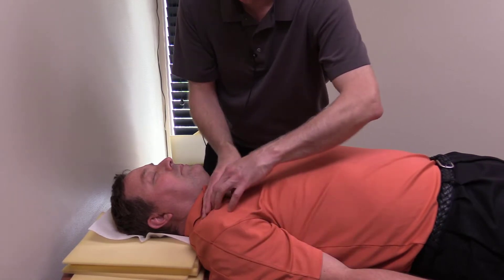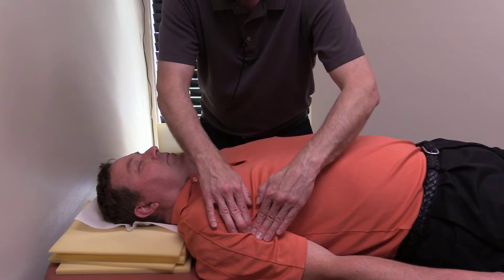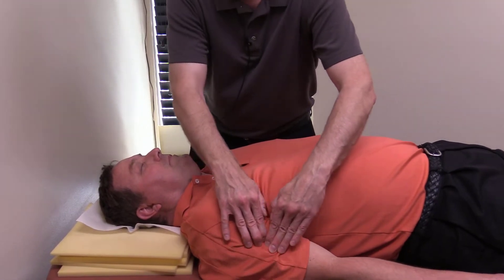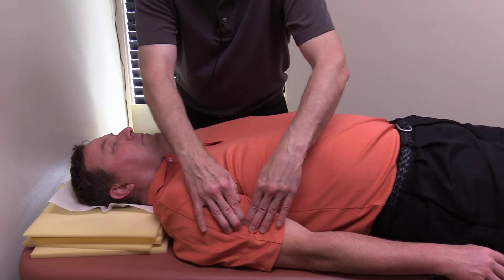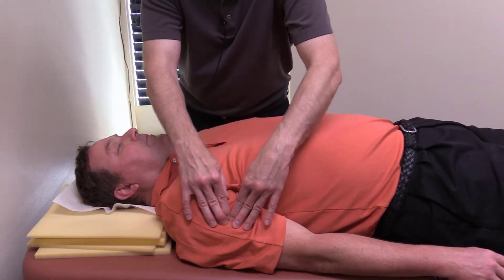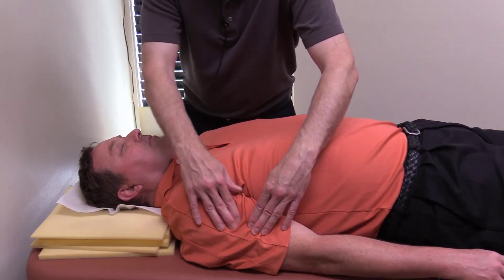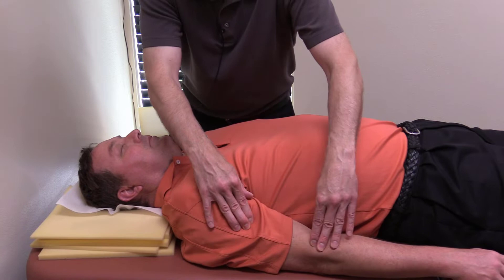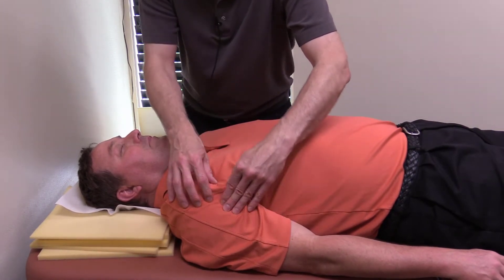Fascially, this all kind of really works together. So if you find spots up here, you're generally going to find spots down here. I can feel some spots down here — this is his lateral intermuscular septum, and this is tight. Feel that soreness right here? There's a knot right there. So I would put a laser there, put a laser up here, and loosen this up too.